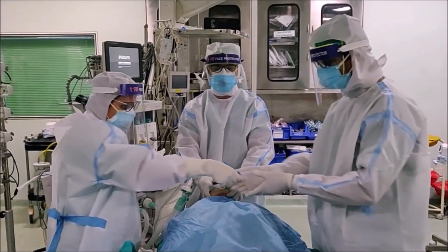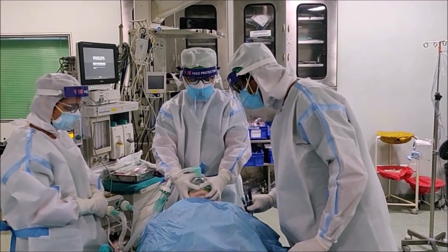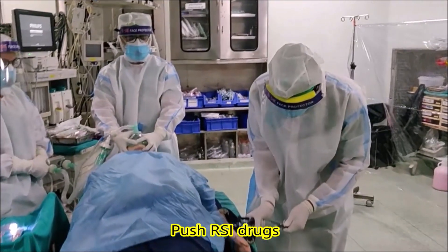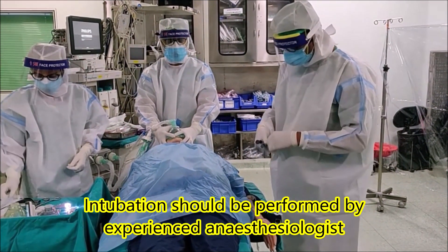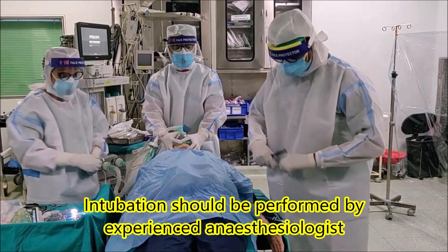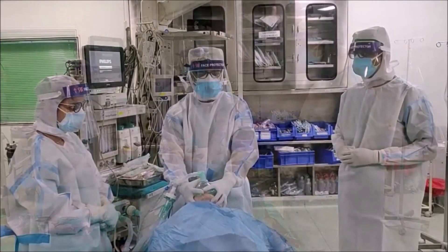Okay, may we have the induction drugs. Now let's take a long breath. Drugs are in. Sixty seconds are up.